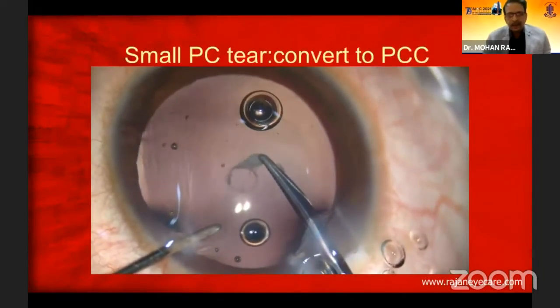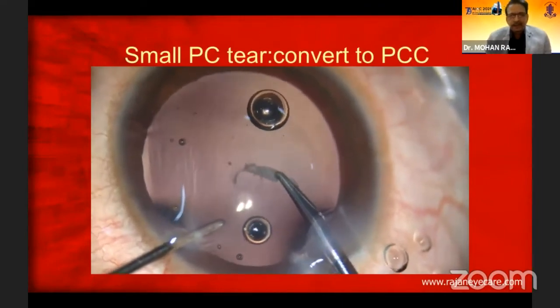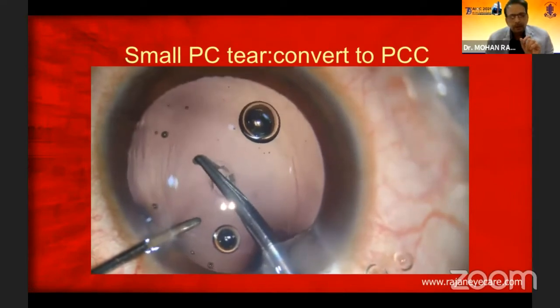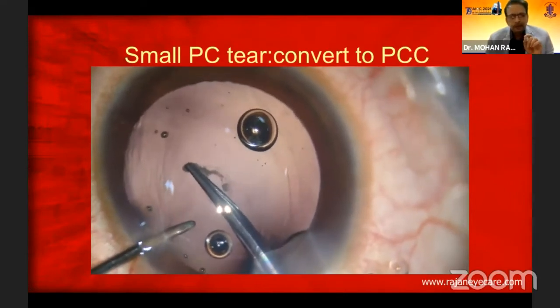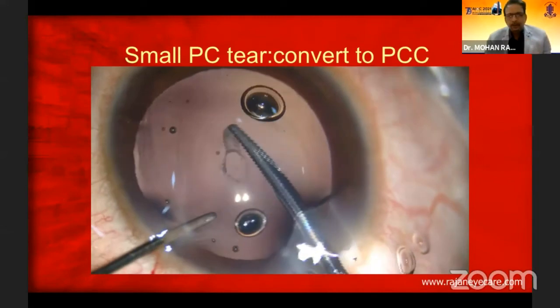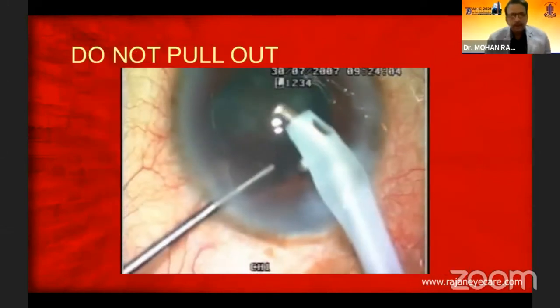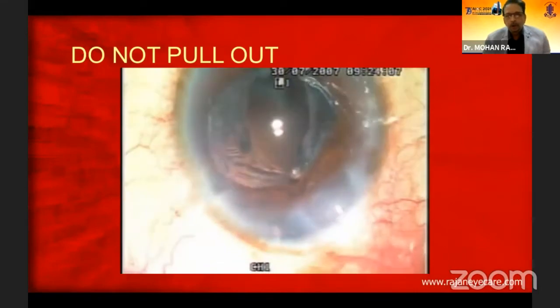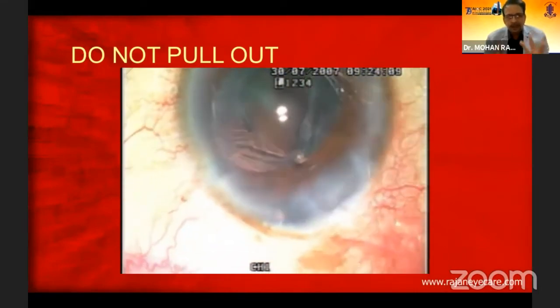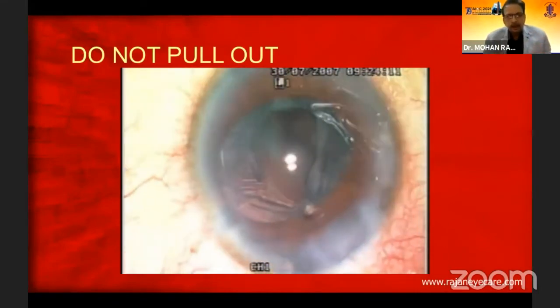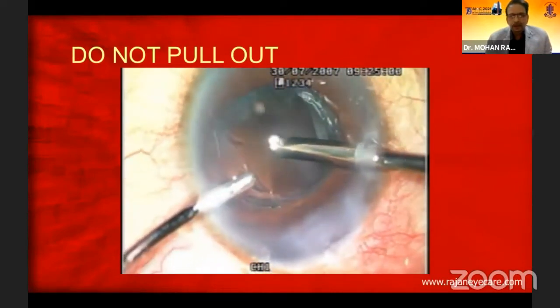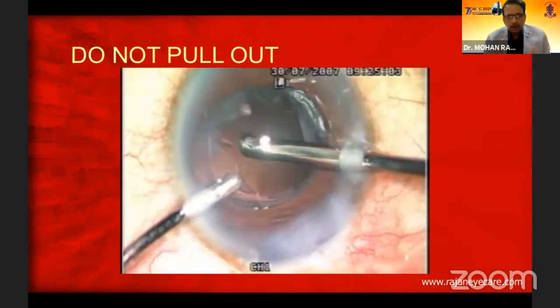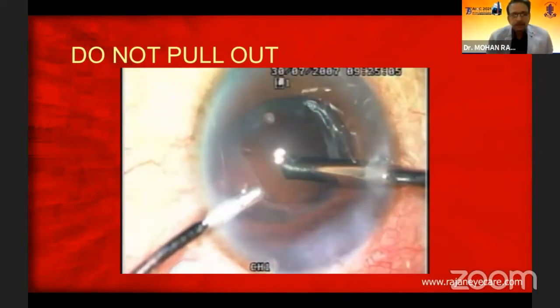If you have a small PC tear, then convert that into a posterior capsulorrhexis. This is very, very important because the posterior capsule rim is always very, very strong and you can go ahead with lens implantation in the bag as well. When you have a PC tear, do not pull out. If you pull out, a small PC tear becomes a huge PC tear, the nucleus can drop into the vitreous cavity, and vitreous starts coming into the anterior chamber.